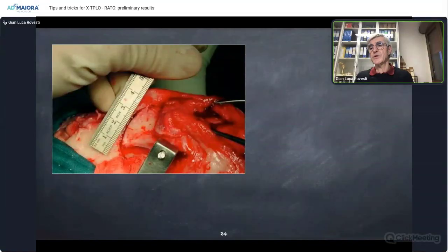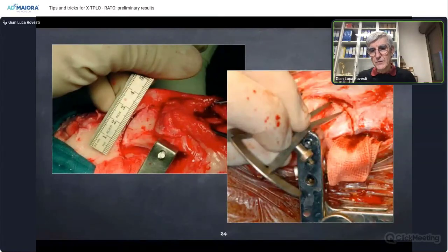With the standard technique, we start with a table that converts angles into millimeter linear measures, and we try to use this measure during the surgery to convert degrees into millimeters and be as precise as possible in order to achieve the planned correction of the TPA.